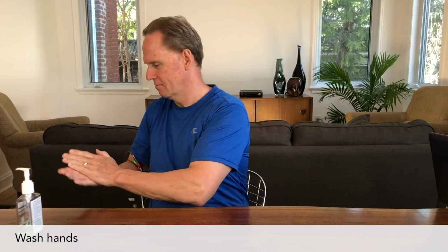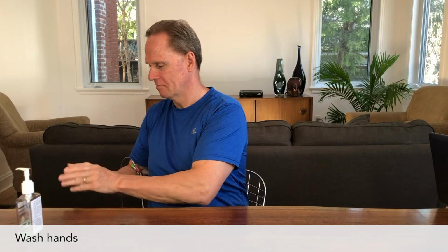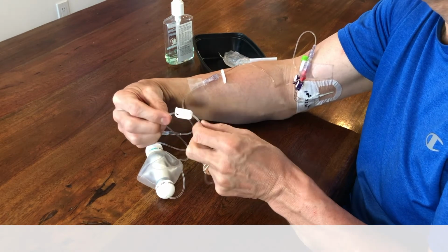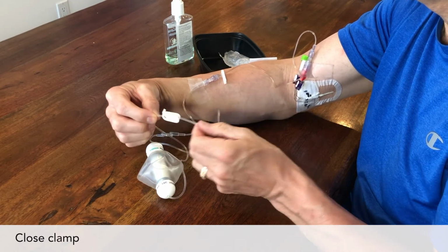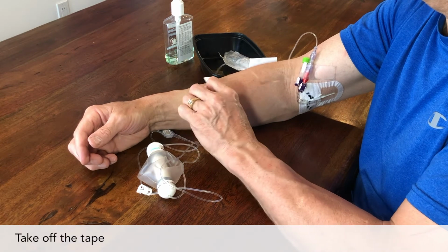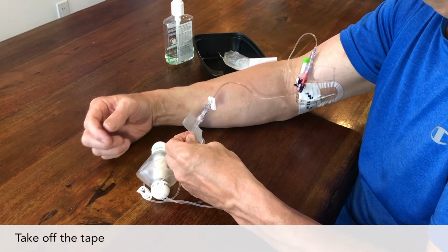Before you touch your IV or pump, you always have to wash your hands. Let's stop the pump. First, close the clamp on the Easypump tubing. Push the white tab down so it pinches the tubing closed. Gently pull off the tape that was holding your tubing against your skin.